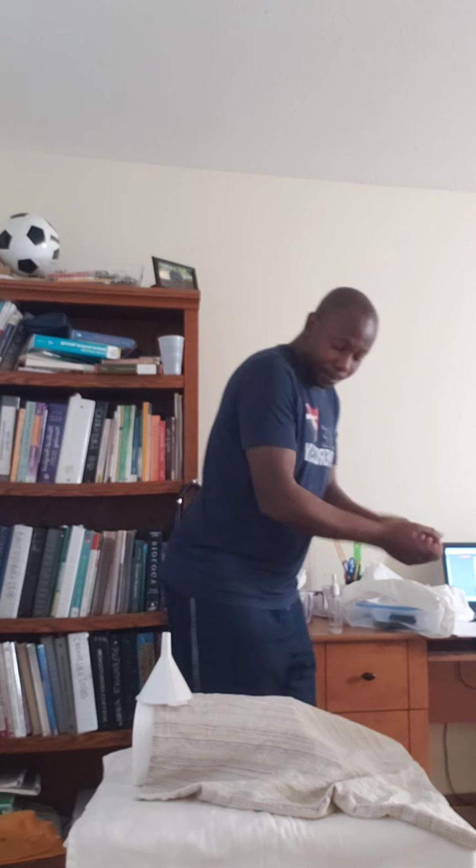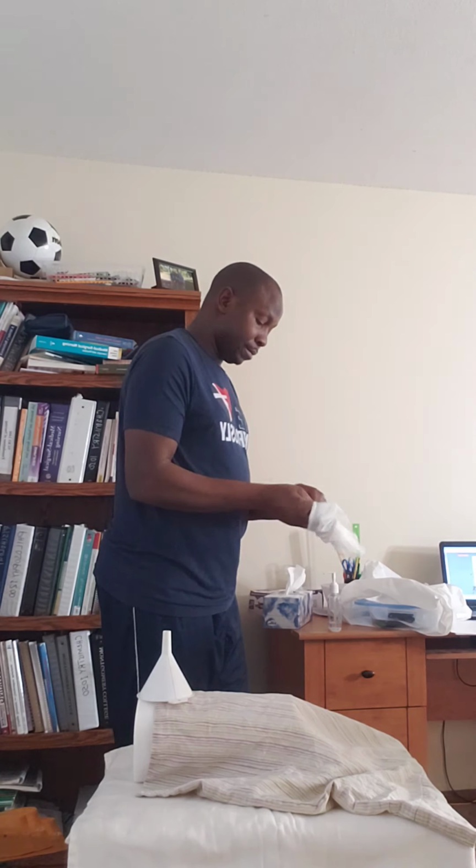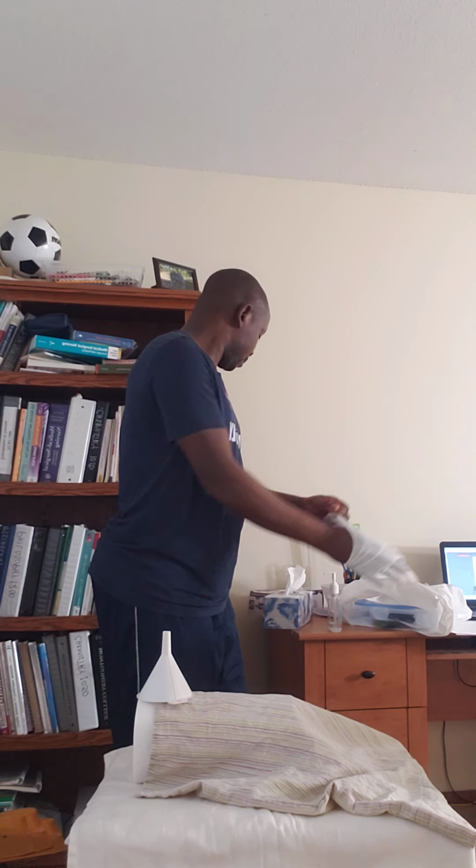Then over there, I'll wash my hands and I'll put my gloves on. This is not sterile gloves. I'm putting my normal gloves on.